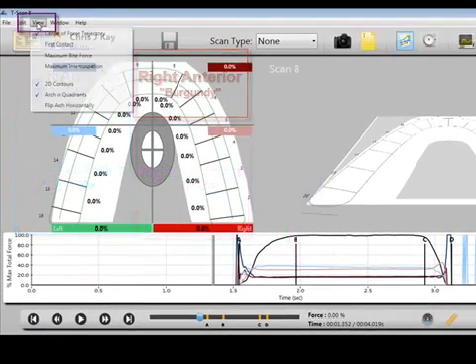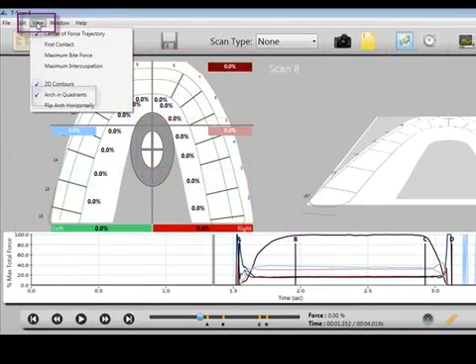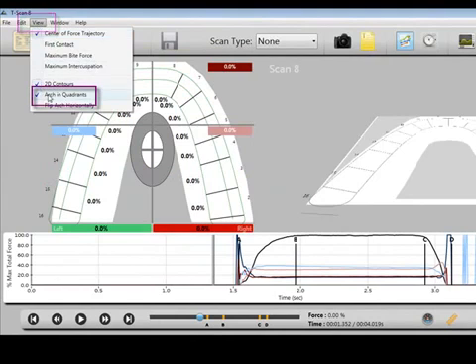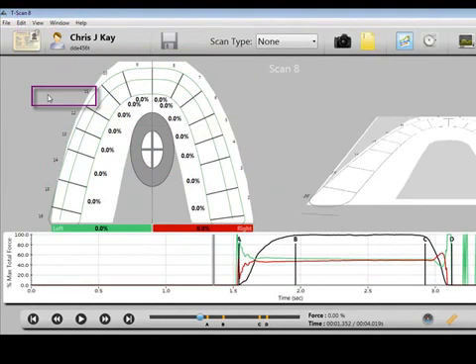To remove quadrants, select View, then Arch in Quadrants.